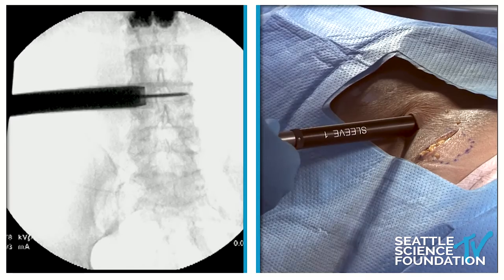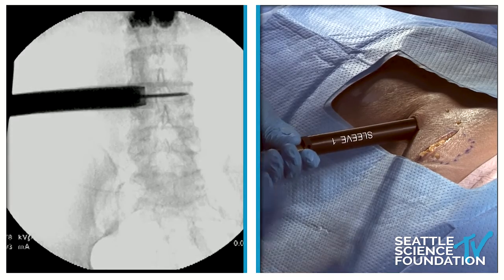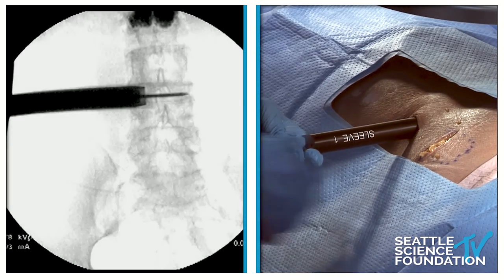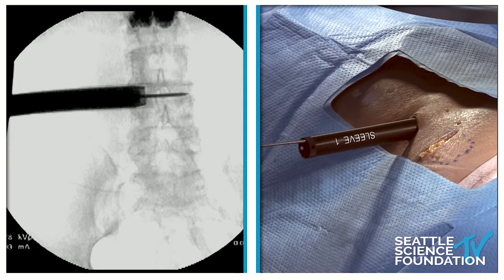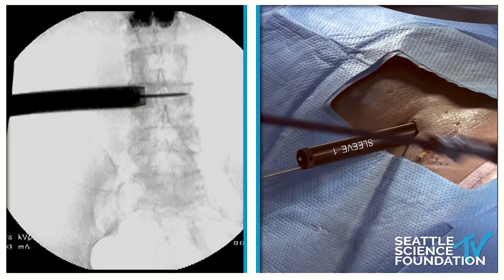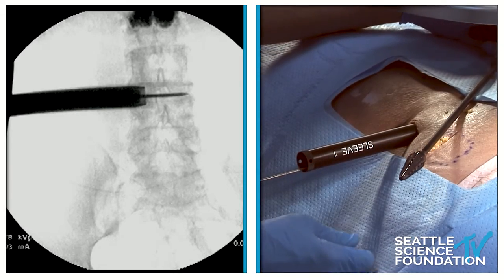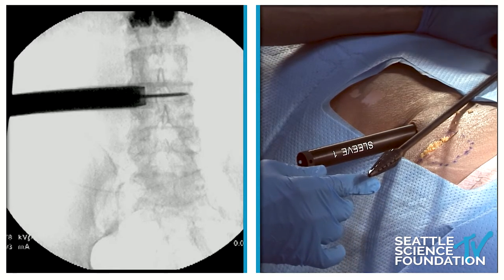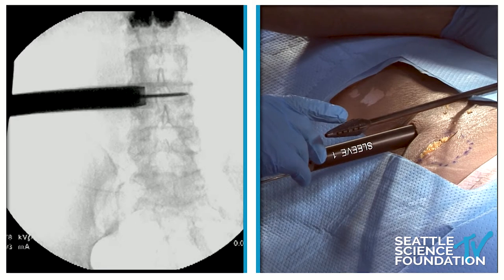We'll dilate up here and remove the internal dilators. We will attach the extension for the Steinman pin — these are rightward threads, so righty-tighty. Over this we're going to put what's called the graduated tap. This is a proximal T-handle. It also has holes, and these holes are sized the same as what we'd previously seen: sized 8, 10, 12, 14, and 16.